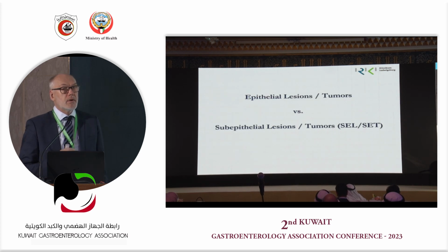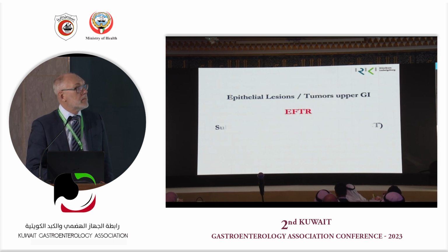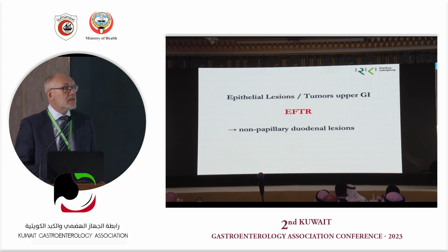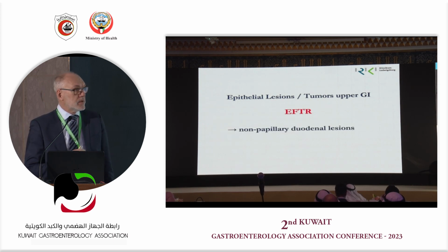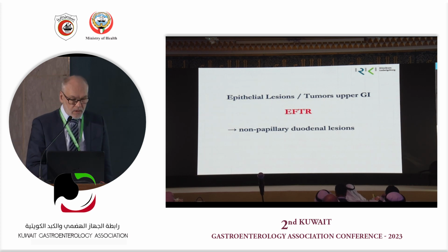When we're talking about endoscopic full thickness resection, we must be clear, what are we going to resect? Are we going to resect epithelial lesions, or subepithelial lesions? Depends. For epithelial lesions, we need it only for the duodenum, because otherwise we can do ESD or EMR, that's fine.